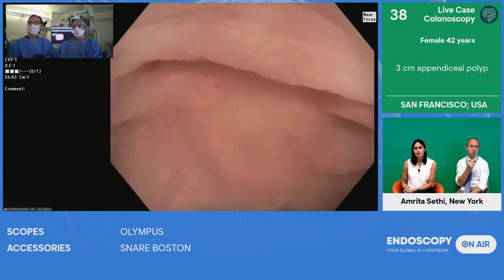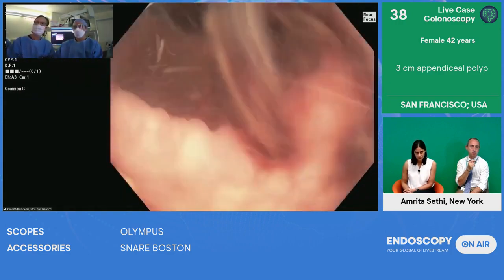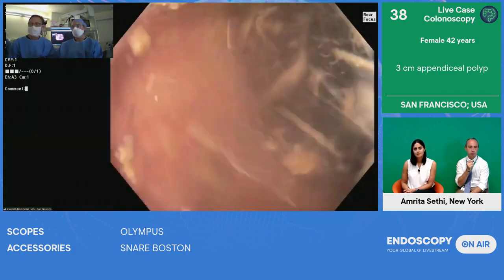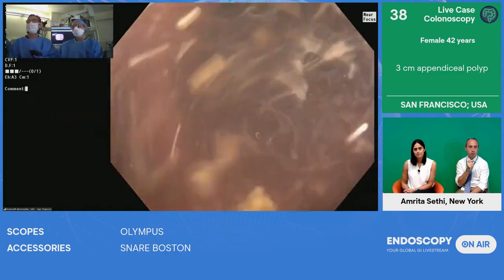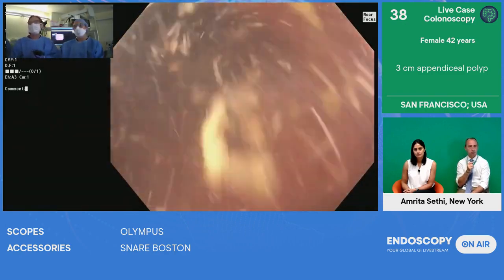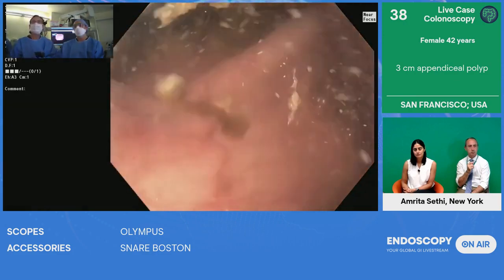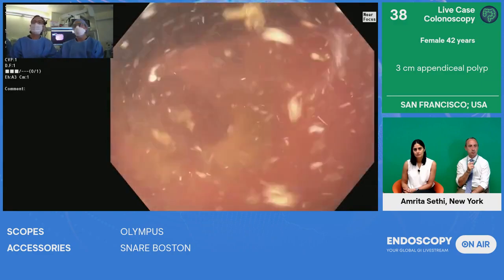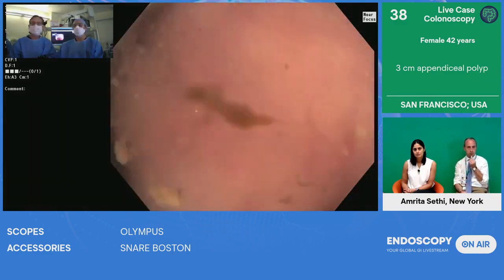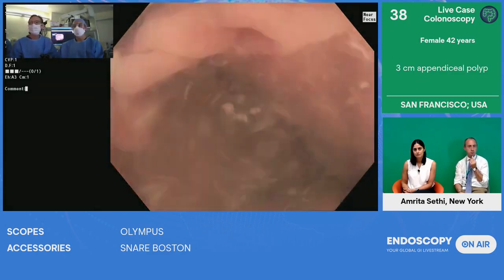All right, now let me just continue. So the water has basically allowed you to not have to do any injection. It's creating the same effect, correct? That's right. But you know, everyone emphasizes the submucosal injection. Now, I won't deny that I have always had an issue with the theoretical possibility of tumor seeding, of dysplastic cells when you inject through a lesion. You know, I'm cognizant of that when I do FNA as well.